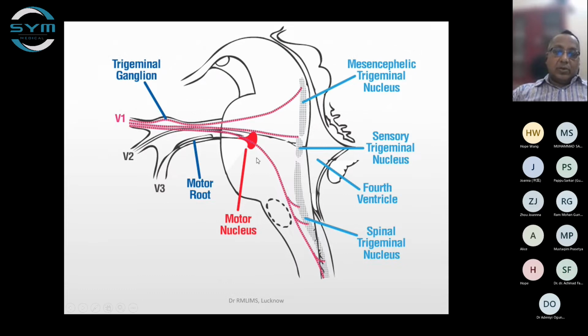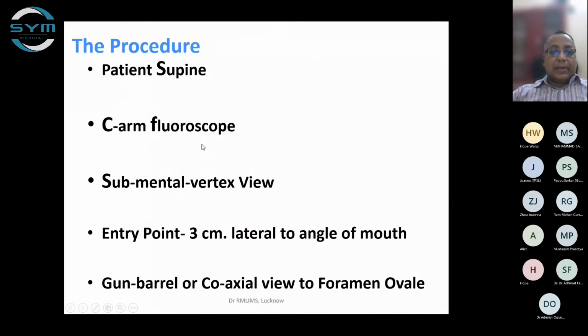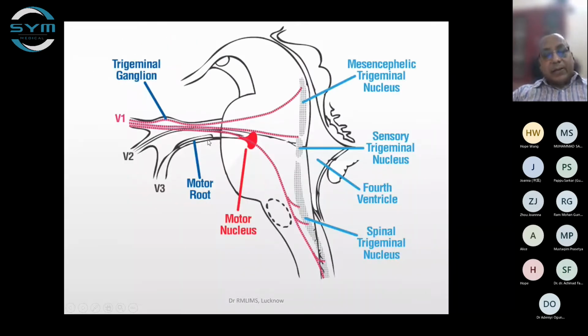Again, this slide is important to show the anatomy. Here you can see the three peripheral branches, and this is the gasserian ganglion, with the trigeminal motor and sensory roots. These roots are coming through the porus trigeminus, the place where you can see the cursor. This has much significance for the ideal pear-shaped balloon. You will come to see it later also. It is very important to compress these nerves if you want the full effect of balloon compression in the trigeminal nerves.